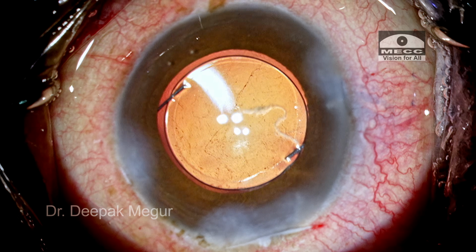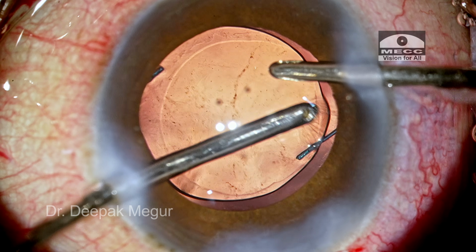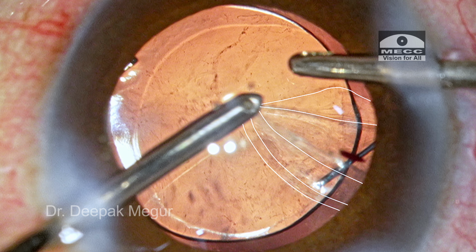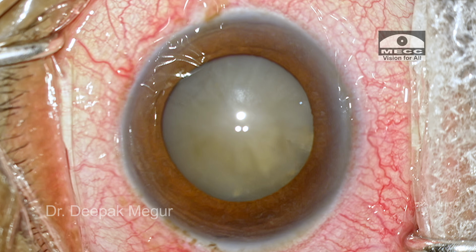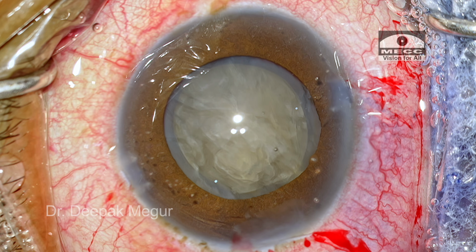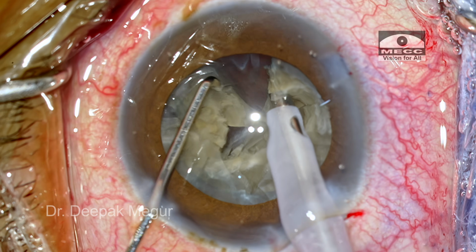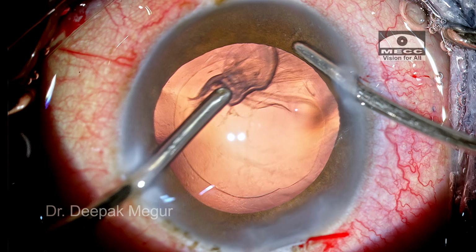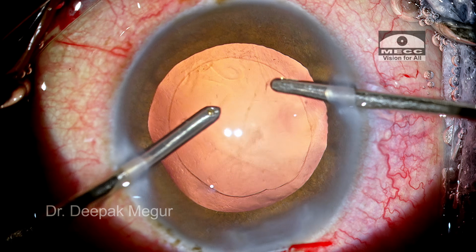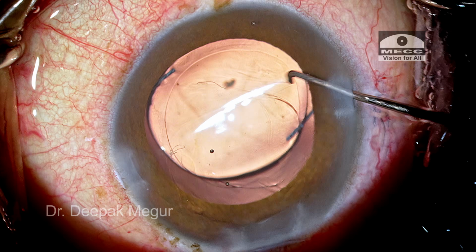Hi, let me take you through a case of an intraoperative surprise. It was least expected and I had to deal with it. Now, this is a 65-year-old gentleman who has had a mature cataract. Nothing significant, seems to be a perfectly routine case. The phaco is done, the cortex is aspirated out, the IOL is implanted.